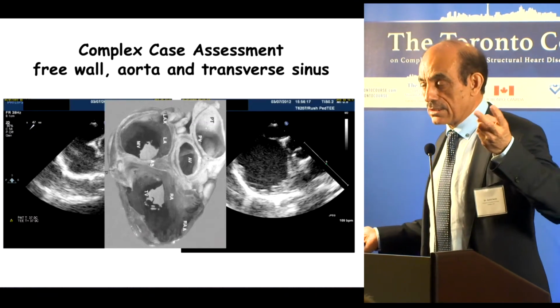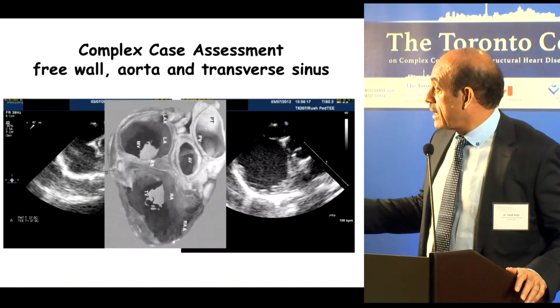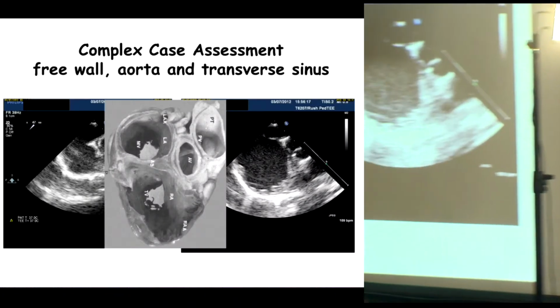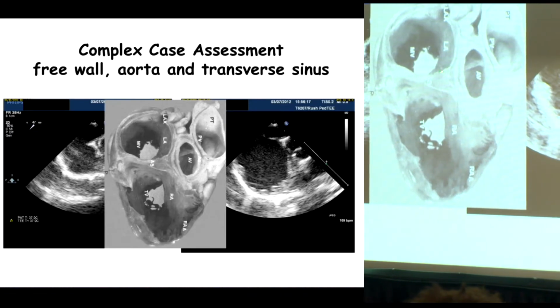Right? There are two sinuses in the heart, right? Oblique sinus and transverse sinus. All right, this is the transverse sinus, most crucial part. Now, if this septum is malaligned, even mildly this way, the device will go like this.